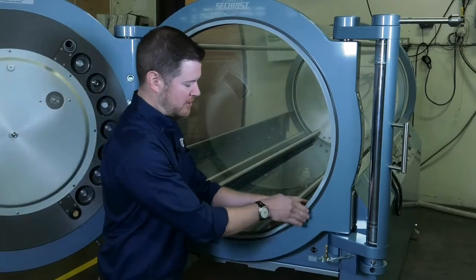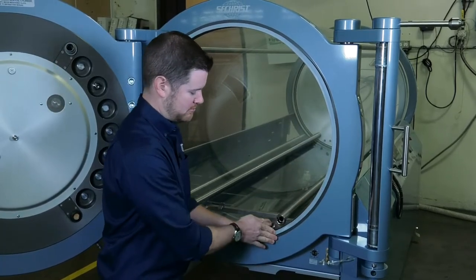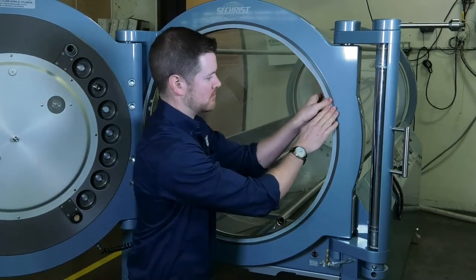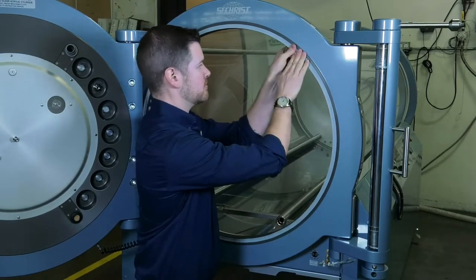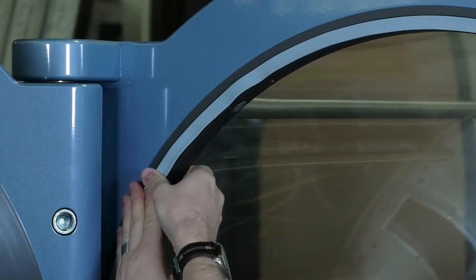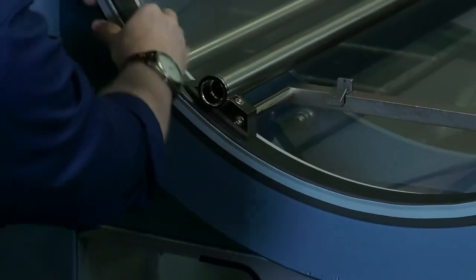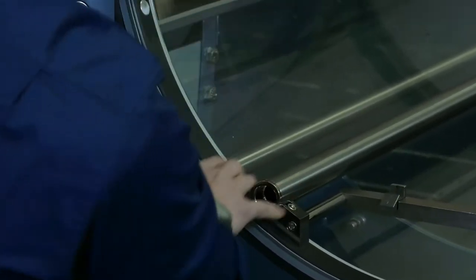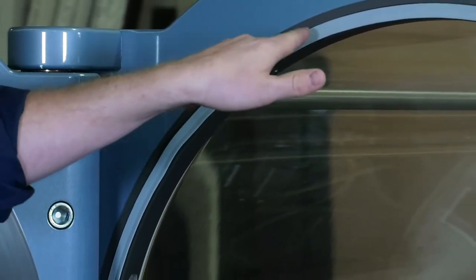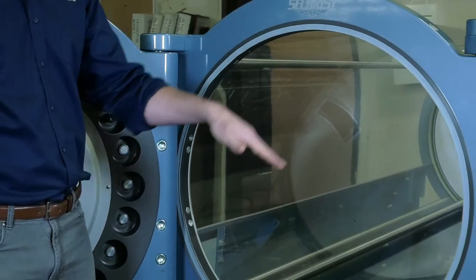Now we're going to just fill in all the spots, pushing in this door seal all the way around the chamber. At this stage, the door seal doesn't need to look perfect. You may notice that it's sticking out in some areas — that's okay. We're going to close the door, and closing the door will reseat the door seal all the way around.